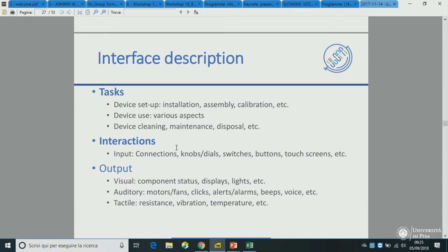After you have made this little creative work, you will have to start describing the interface. So what are we doing? Which is the first button we have to push, and which one is the second button? There is a very nice article out there in PubMed where they divided the interaction between the person and the glucometer into 54 different steps. Of course, it is literature, but it is actually very complex, okay? Even the use of a very silly medical device.